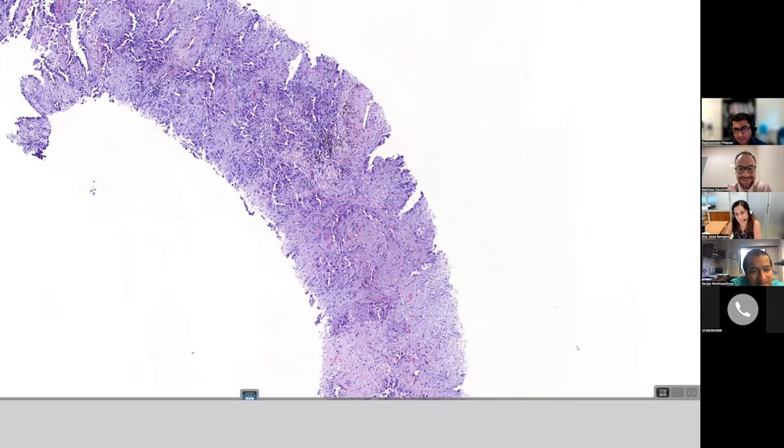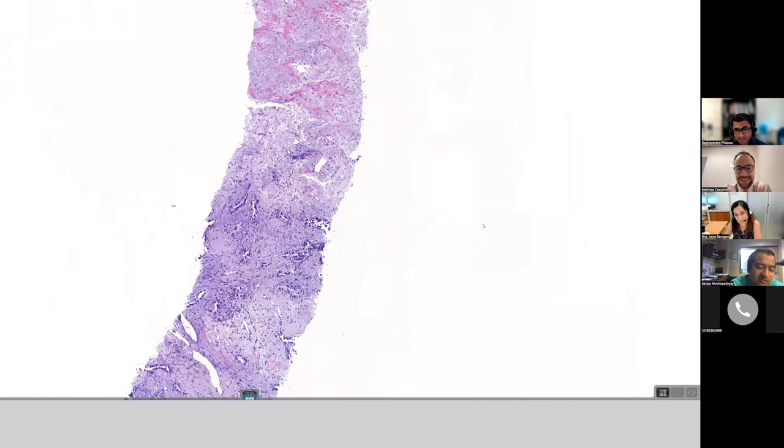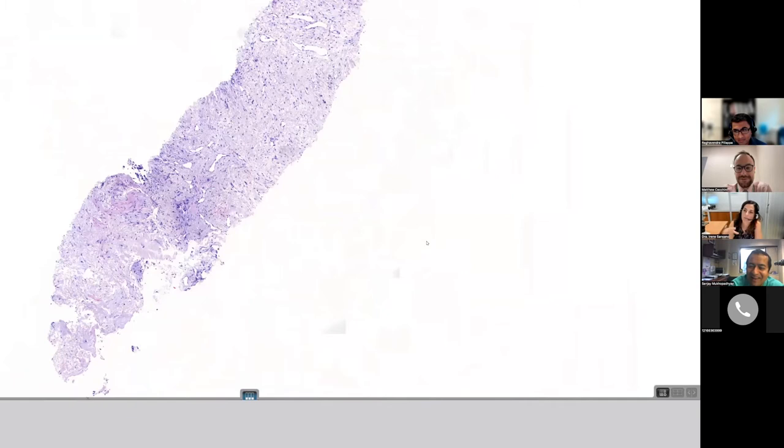So here I would say it probably is around half and half if you consider all the non-stroma. So maybe 50% would be my guess here. It's completely non-scientific, probably completely inaccurate. The point is we have to think only in the nuclei, not in all the tissue. So from the nuclei of these fibroblasts and vessels and lymphocytes, how much is it?